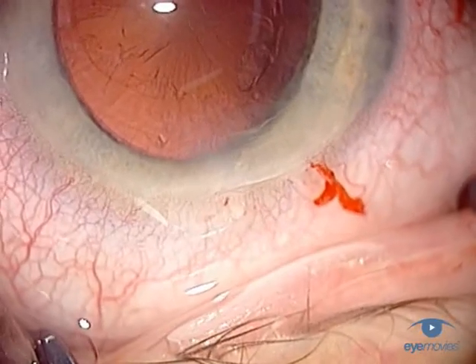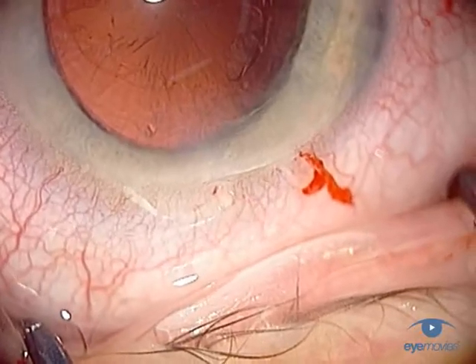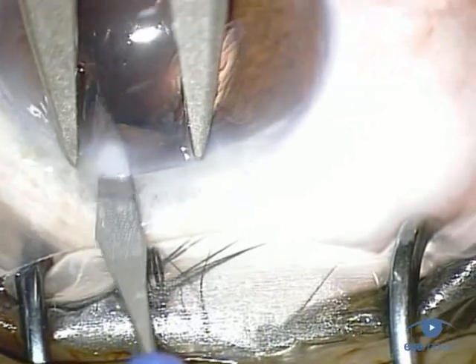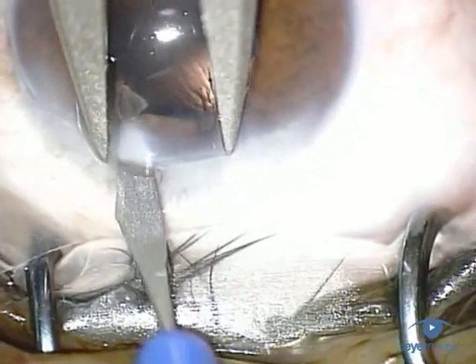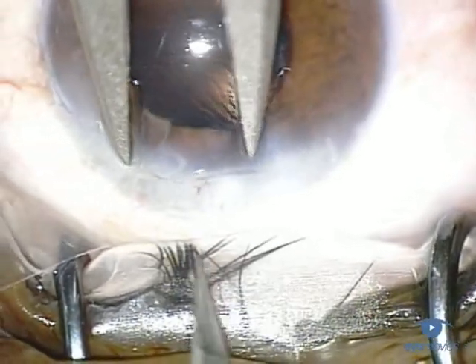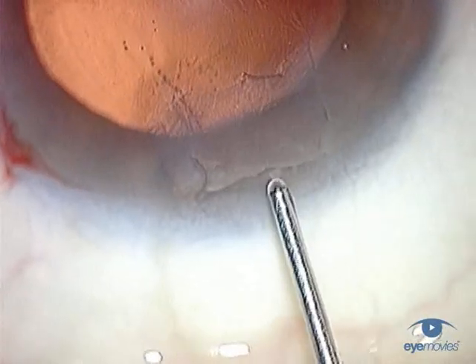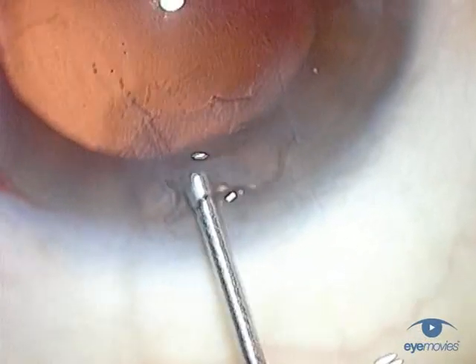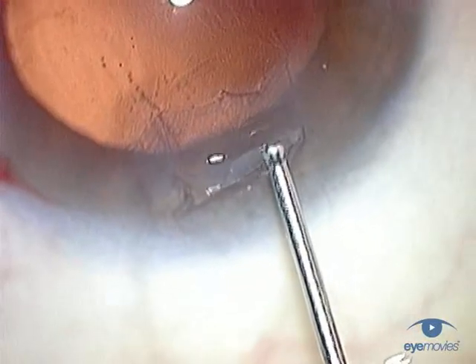Firstly, the stab incision is a little less consistently self-sealing. Secondly, if you have to enlarge it, it can be difficult to still maintain the precise architecture that you need for wound stability. And finally, the posterior edge of the roof is sometimes very thin and feathered, and consequently vulnerable both to tearing and the effects of wound burn.